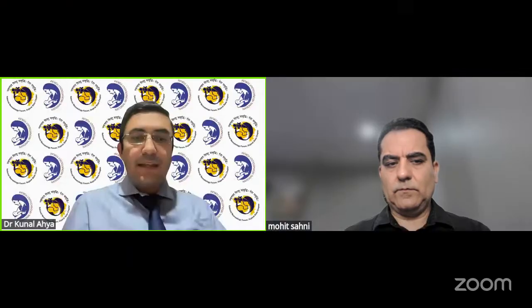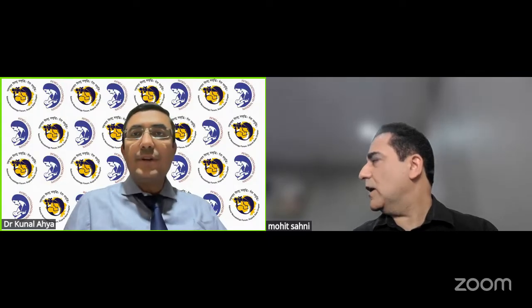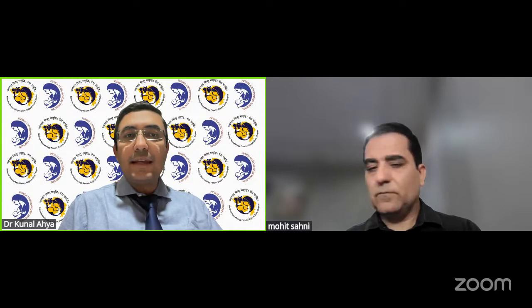So today we are continuing with our POCUS series, series 29 we have reached. And today we are going to talk about the ET tip and central line tip localization.